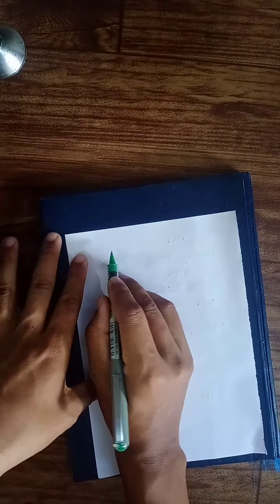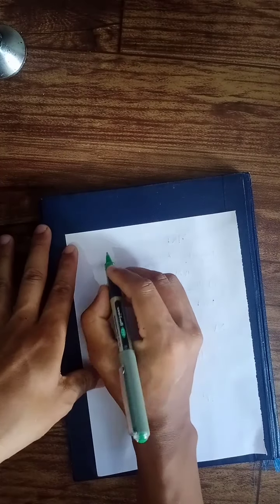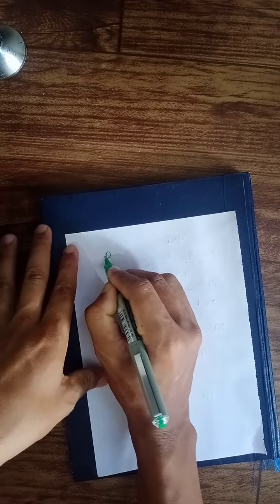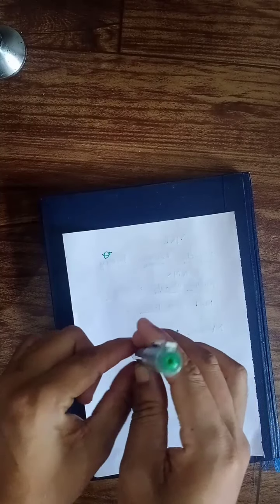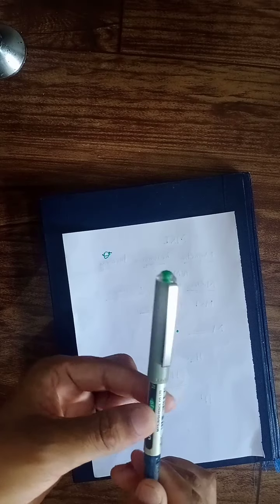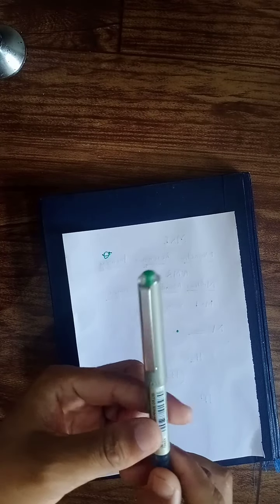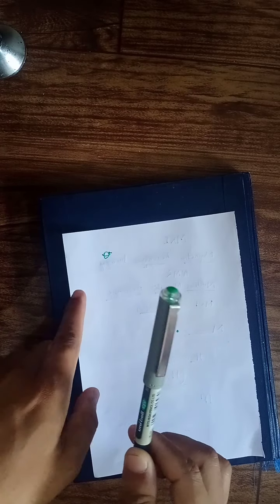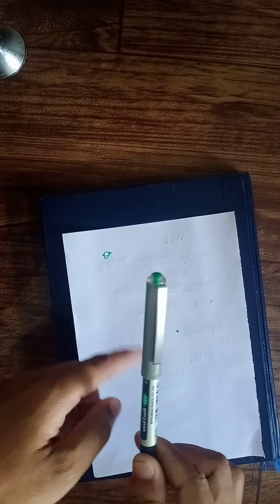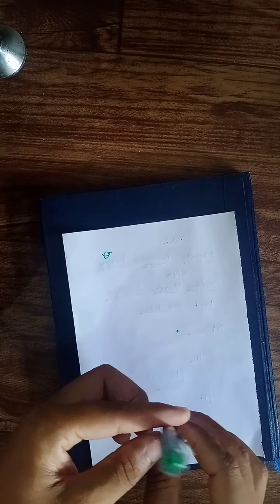So let's flip the page and get started with a bit more detail. When we talk about hydrogen, it spins. Let me show you with the pen. When I talk about spin, it means spinning, right? Everyone might know the meaning of spin. But here the proton not only spins, it also precesses.